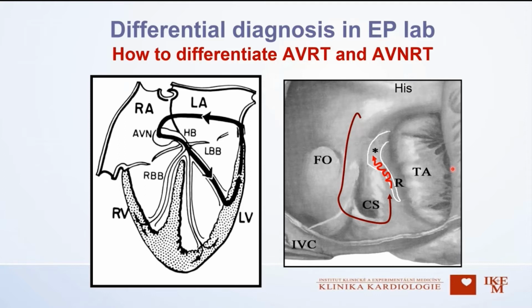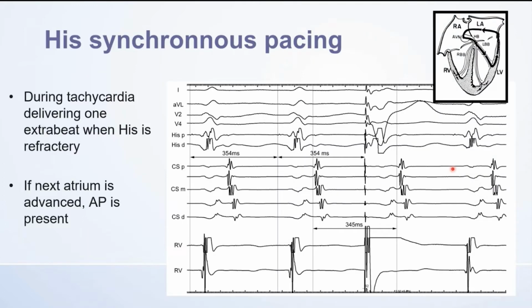There are a lot of maneuvers to differentiate different arrhythmias, but I would like to stress two tests that we use. You should have some maneuvers that you are used to and that are available for you.